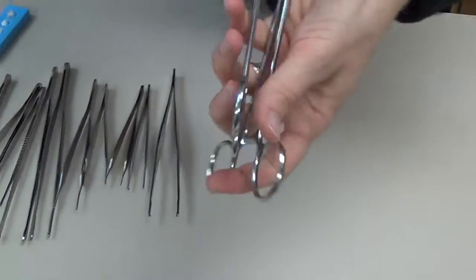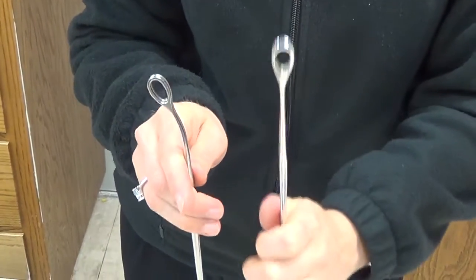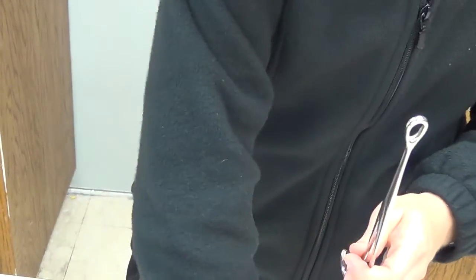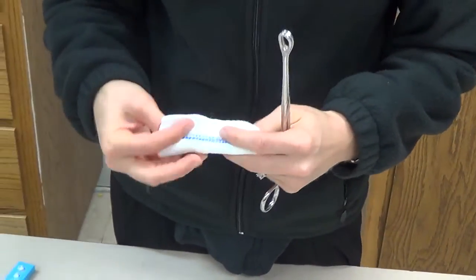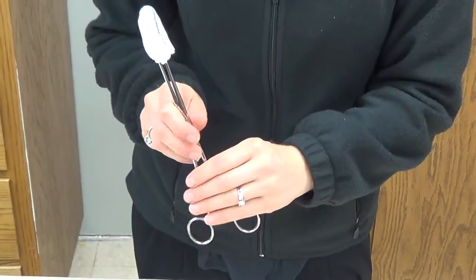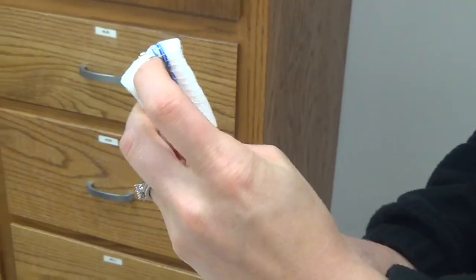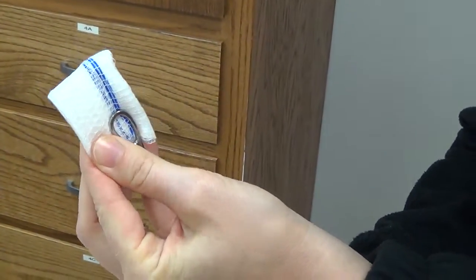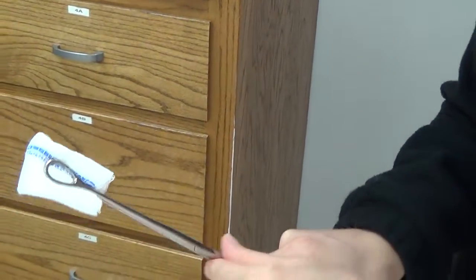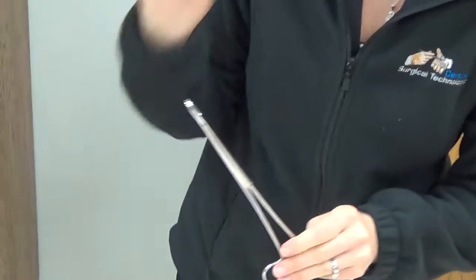The next instrument is the ring forcep, or the Forster ring forcep. It has a ring at the end and comes curved and straight, though most commonly we use it straight. The ring forcep is most generally utilized loaded with a Raytex sponge folded in thirds and loaded on the tip — when loaded this way, we refer to it as a sponge stick, used for blunt dissection inside the wound. Make sure the sponge is firm at the tip — not too high so they're dissecting with the instrument, and not too low so it's floppy. We also use ring forceps to clamp onto the uterus during a C-section to help with hemostasis after the fetus is delivered.